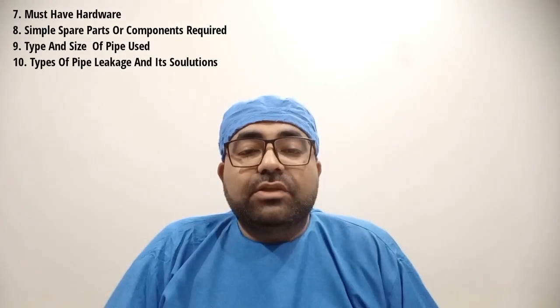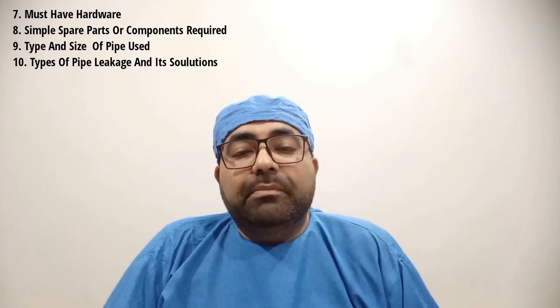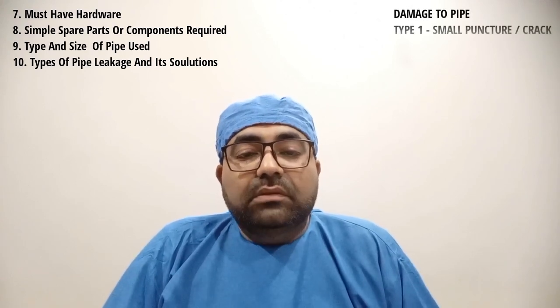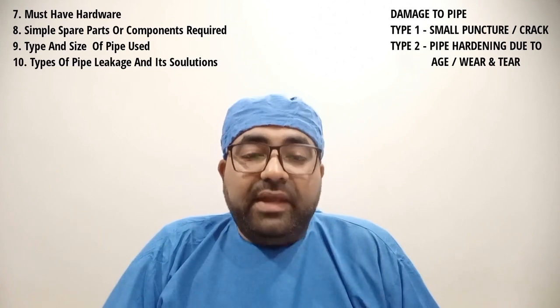So up till now we have our tools ready, our joiners ready, and our tubings ready. That brings us to point number 10: types of pipe leakages and its solutions. The two main types of damage that occur to pipes in dental chairs are type number 1, small cracks or punctures, and type number 2, pipe hardening due to aging and wear and tear.